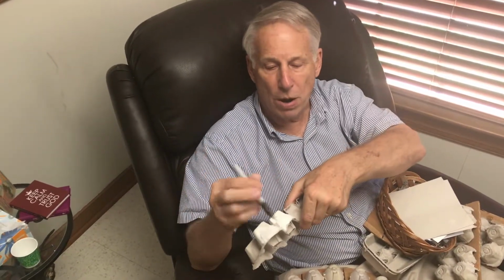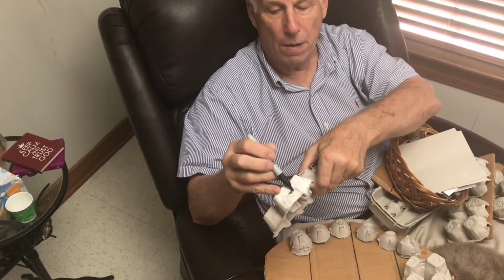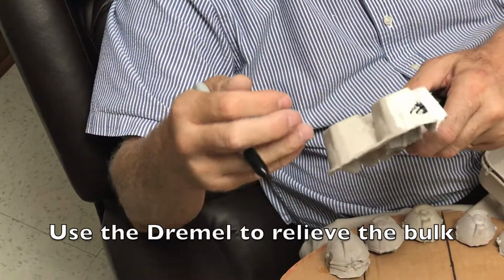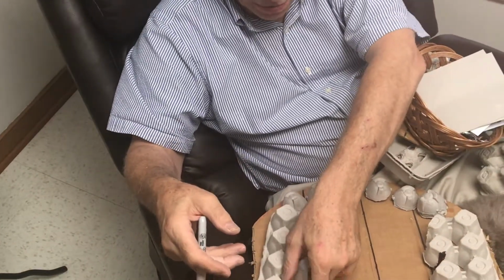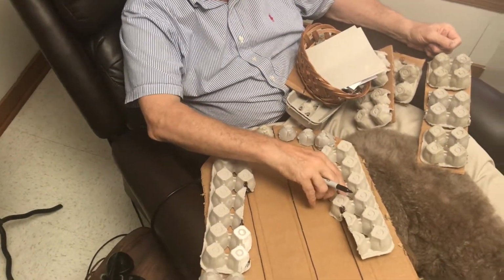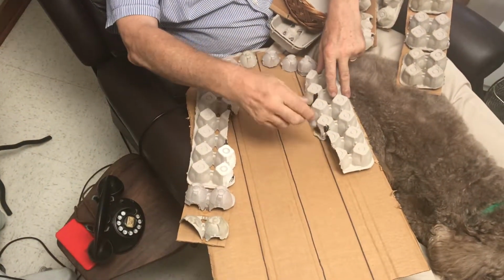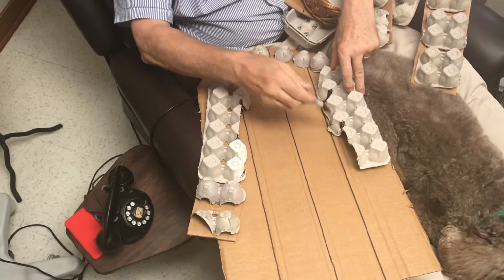And what that does is mark, a lot of times the tongue, as it's coming in, is slamming into the back of this, okay? And it's marking down here. You want the tongue to come up here. So you have to mark that with PIP, and then you have to relieve it and you keep relieving it till you get the tongue up here. And then on the other side, you have to do the same thing. You shouldn't be contacting much there on the back. And then no more contact should occur in the back, but all of a sudden you may have the same contact occurring here, and you have to take it off.